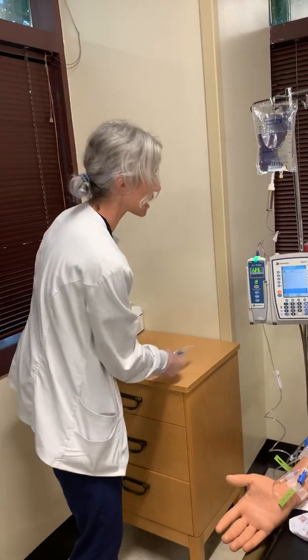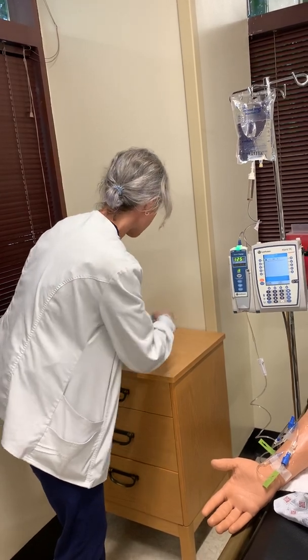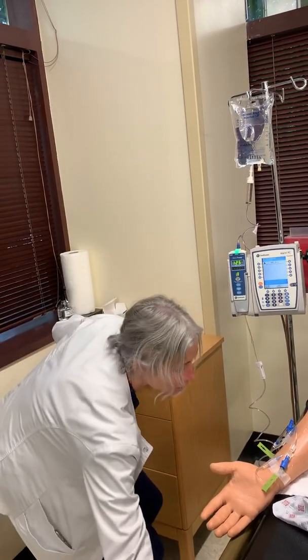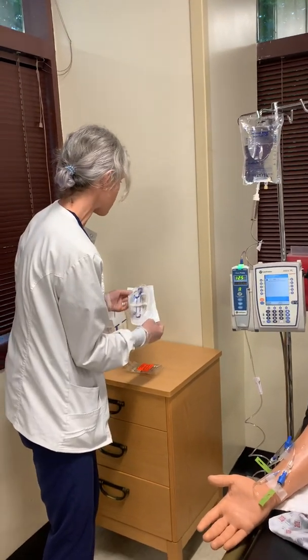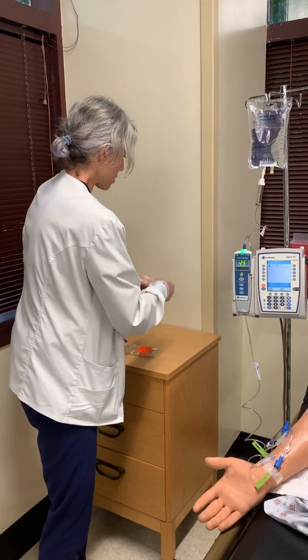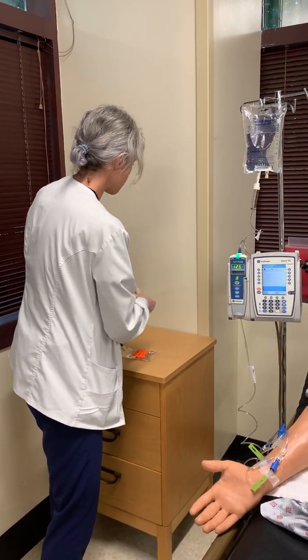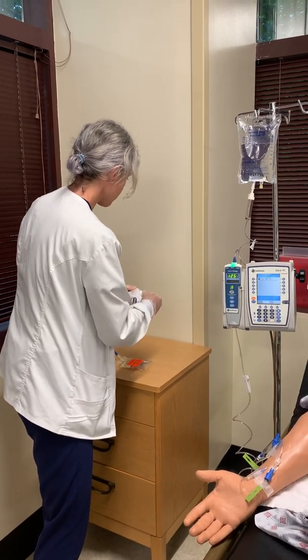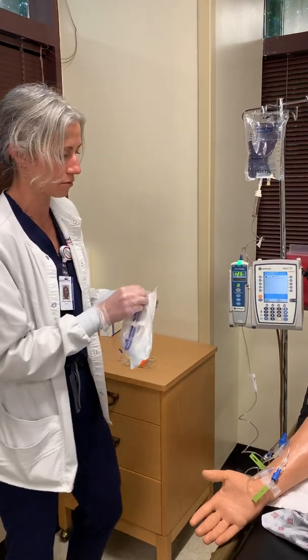So I've got all that set up. I like to always get this set up before I get my pump set up. So I've got my trash can over here. You guys will maybe learn about back priming, which we'll teach you about later, but in this case, I'm going to go ahead and just prime it myself, okay? So I'm going to open up my bag. And you see the blue thing in here. There's a reason that I can't open my bag.